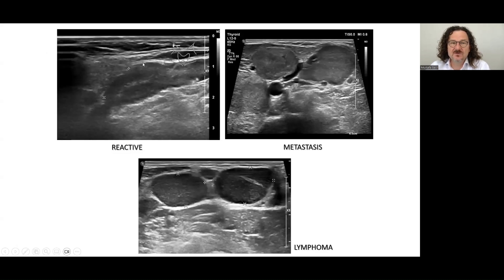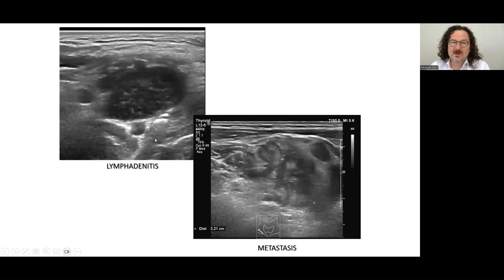This is a reactive lymph node — you see the margins but not as discrete. This is metastasis and this is a lymphoma — very well-defined margins. In non-specific lymphadenitis, you see the rupture here, the margins are lost. And this is an aggressive tumor — metastasis — you see the margins are lost.